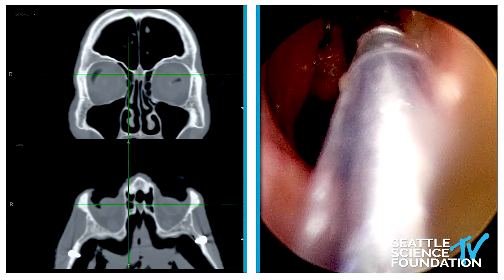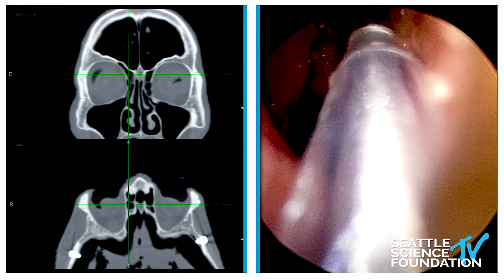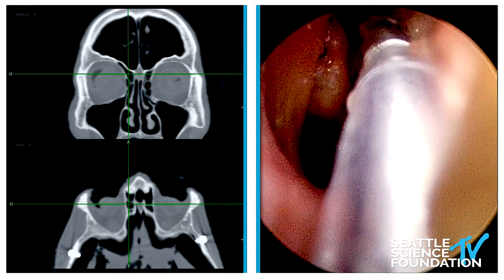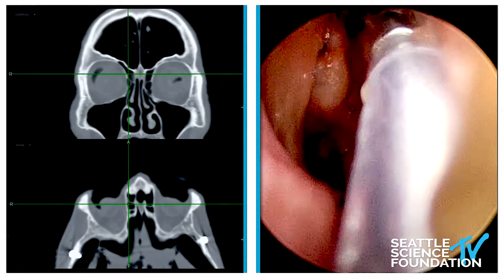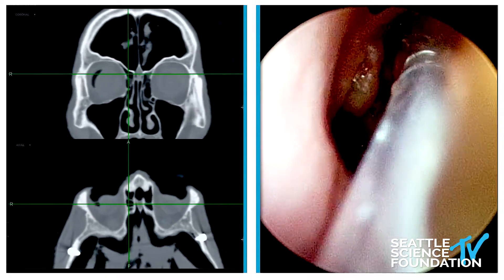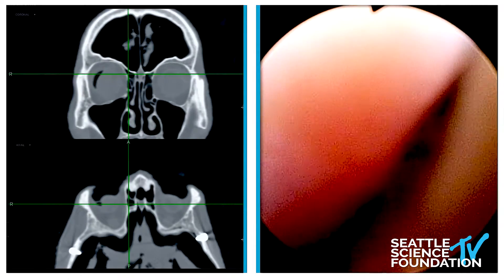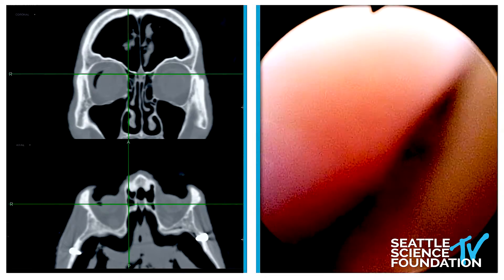We see anterior to the green crosshairs a super agger frontal cell that's right anterior to me. It's a cell above the agger, which makes it a super agger cell, but it's going into the frontal sinus — so it's a super agger frontal. That's important, because the natural drainage pathway of that frontal sinus is going posterior to that cell. We can get right up there and dilate that, which is going to squish those cells. Sometimes I want to dilate inferiorly first to create a little more access, then advance it further to get the tightest part between the most superior part of that super agger frontal cell and the skull base.